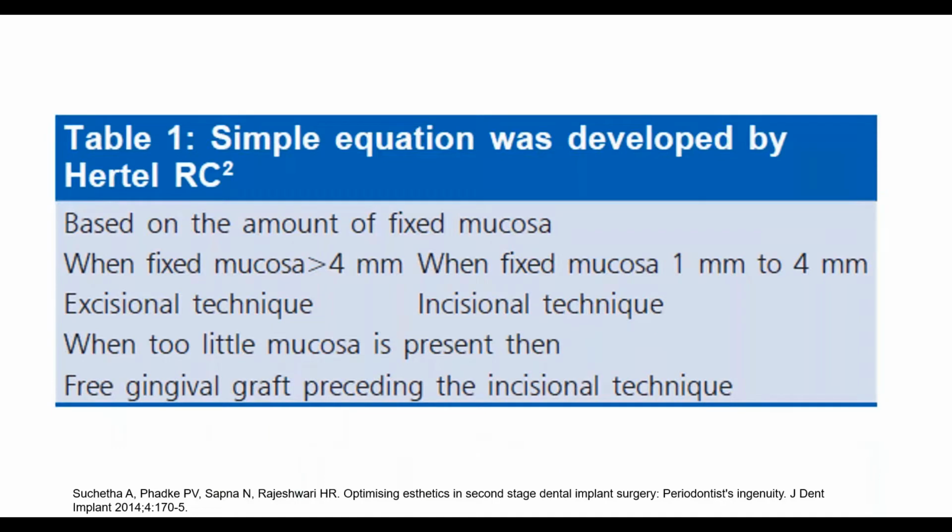The criteria given by Hertel et al. state that for second stage surgery, it depends upon the width of the fixed mucosa and the keratinization thickness of the mucosa, whether to go for the excisional technique or the incisional technique for the second stage.